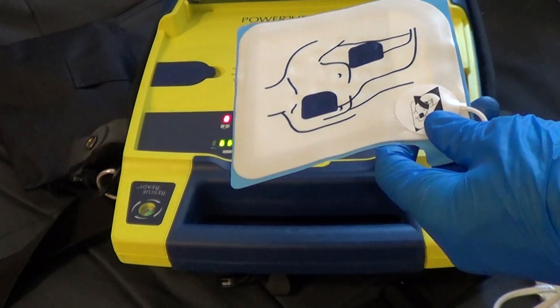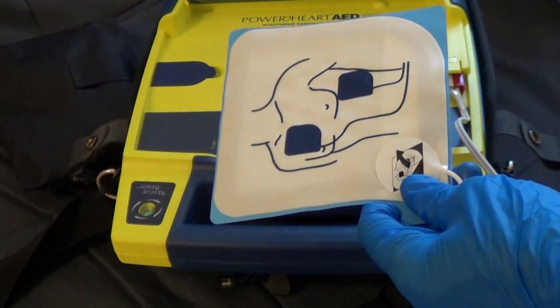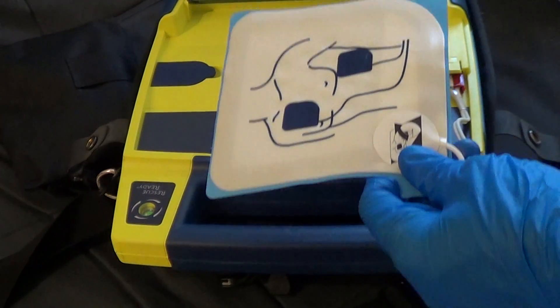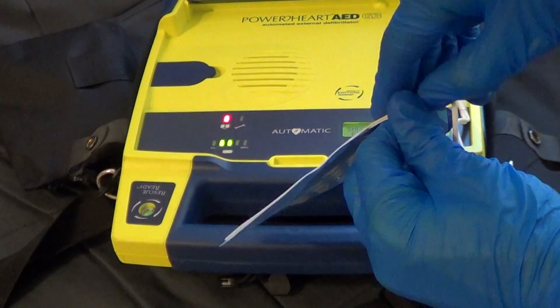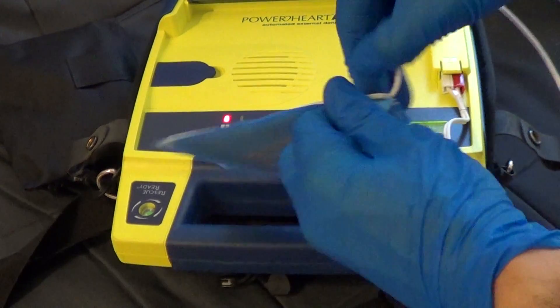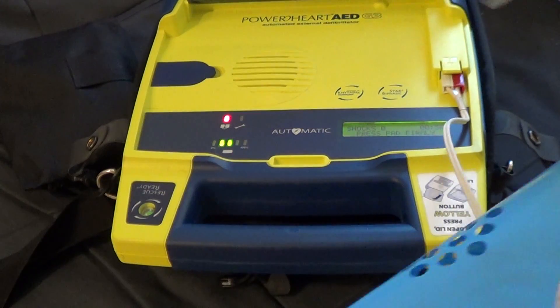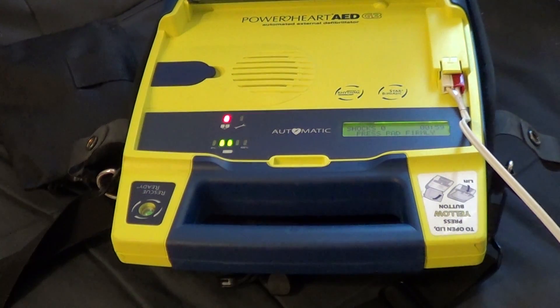Place the pad without the liner on the patient exactly as illustrated. This pad can be placed on either of the two locations shown. Next, peel the blue plastic liner off of the second white pad and firmly place the second pad on the opposite location exactly as illustrated.